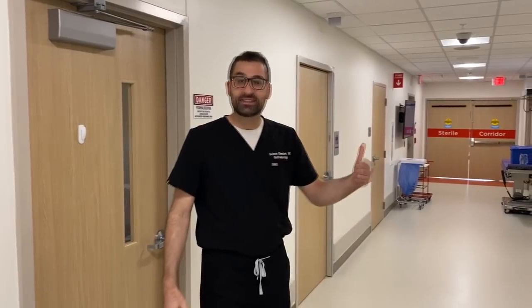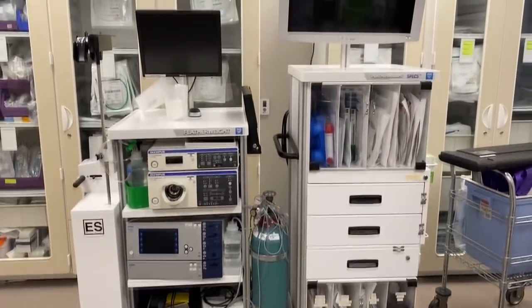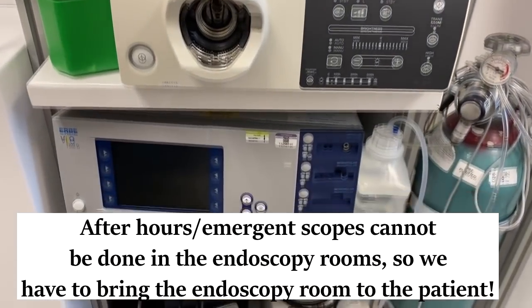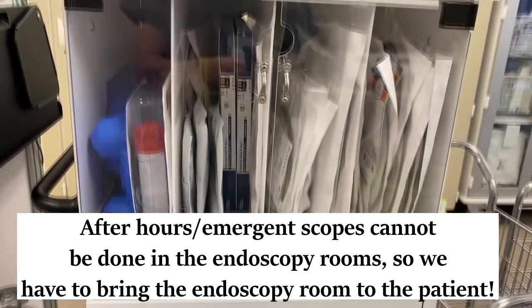Hey everyone, you have an urgent scope. Let's go get the cart. So this is our mobile endoscopy cart. It's equipped with everything we need to be able to do an endoscopy, and we can move it anywhere we want in the hospital — ICU, operating room, emergency room.